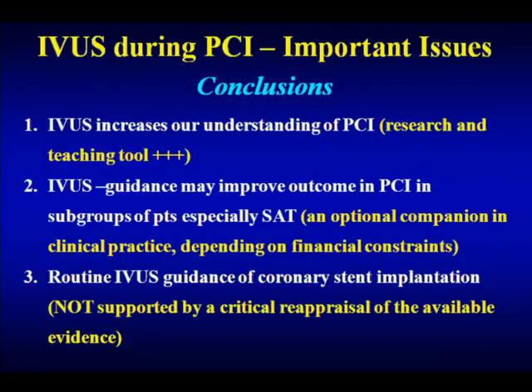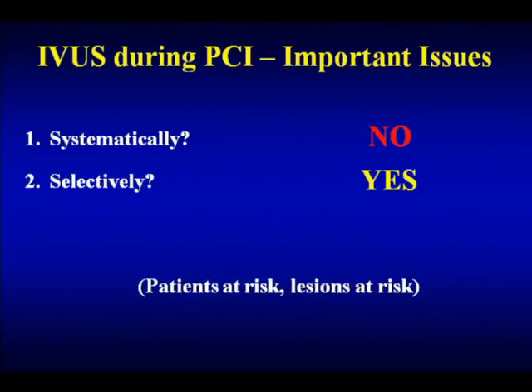Now, what is the case? There is a patient who needs to go for surgery, where you have to stop the antiplatelet therapy. To be sure the stent is fully expanded and apposed, you could make it a point to do IVUS, ensure good stent expansion, and maybe in this patient you can decrease stent thrombosis. Routine IVUS guidance is probably not supported by the various studies, and we still need a randomized trial to answer this question, particularly in the DES era. Therefore, I would say that IVUS with the DES, yes, selective cases have a role.